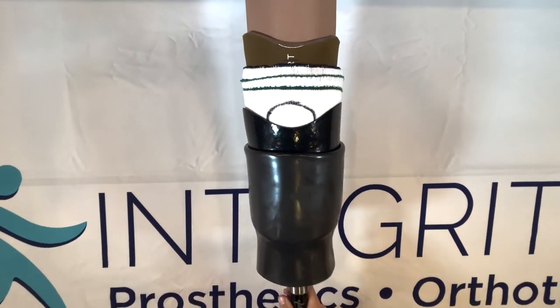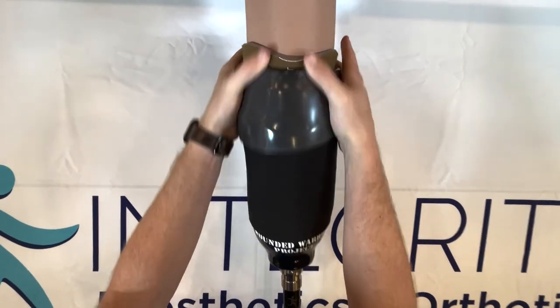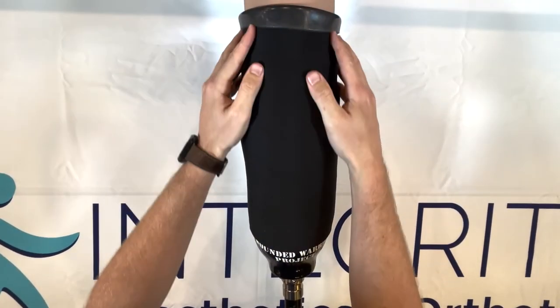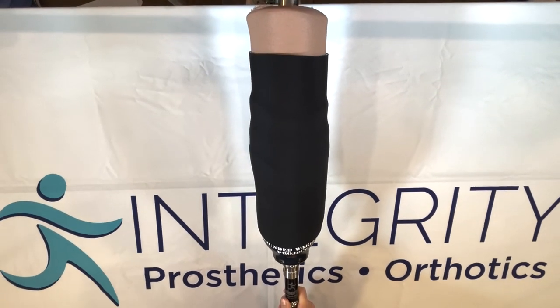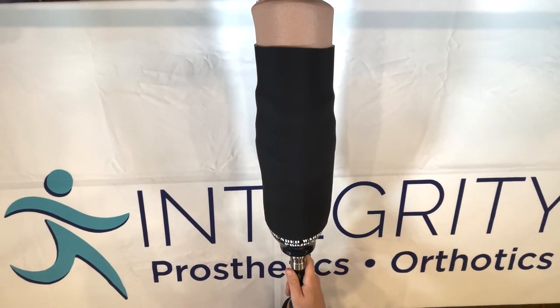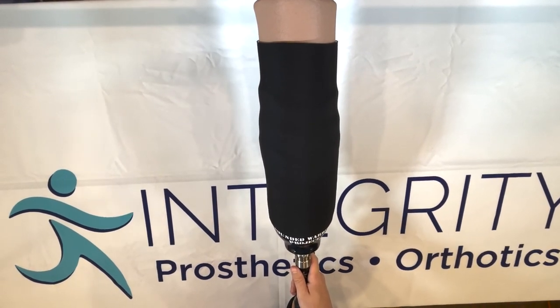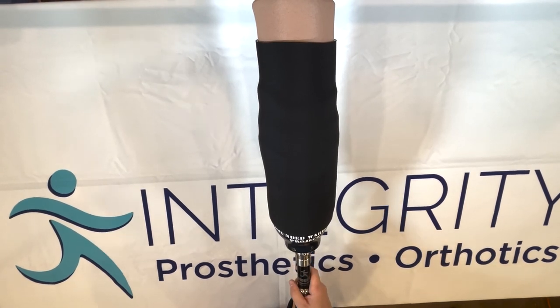We're just going to take that sleeve and pull it right on up about that high. If you ever have any questions on how many socks you need to be wearing, or if the prosthesis still isn't fitting right whenever you add or subtract the socks, please give us a call at 863-937-9200.